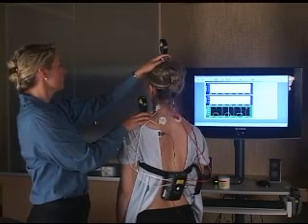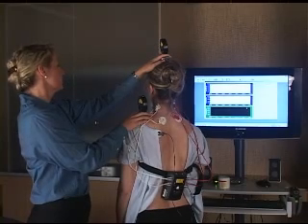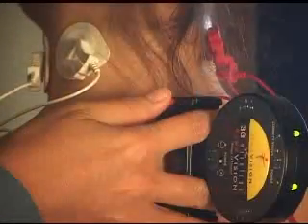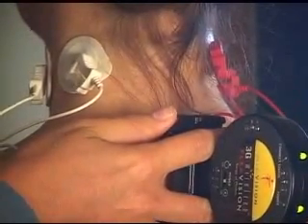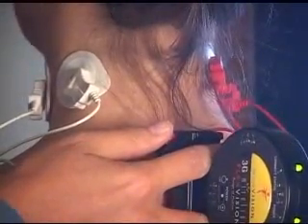Again, if you're done and you want to move on, don't pull the FlexVisions off the body, but simply hold the button down for 2 seconds and it'll move you to the next screen. So you press and hold the button for 2 seconds and then release it, and it'll move you to the next screen, so you never have to touch the computer's keyboard while doing this test.